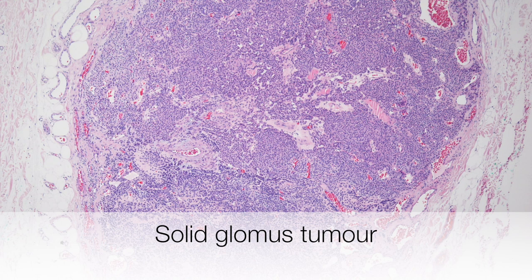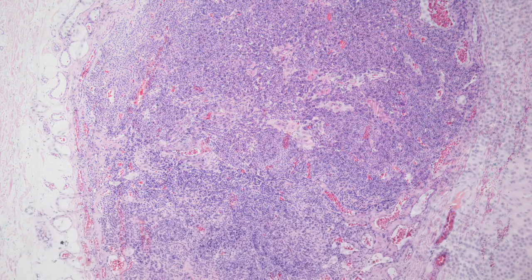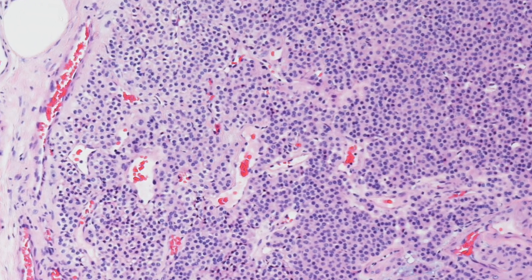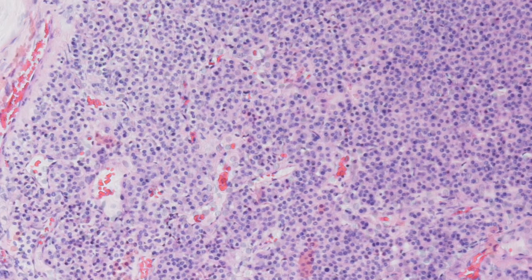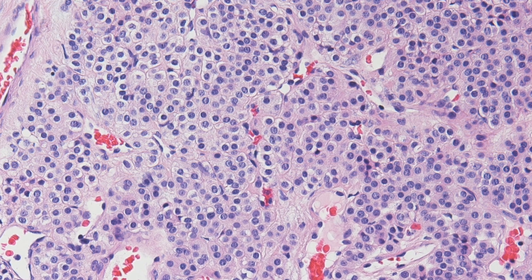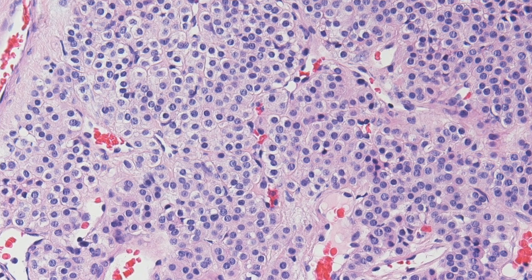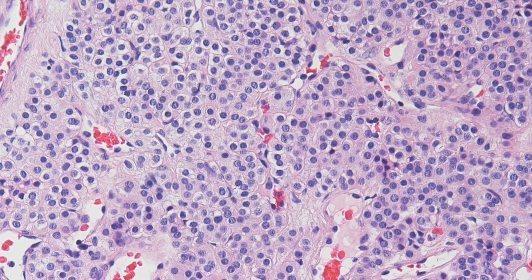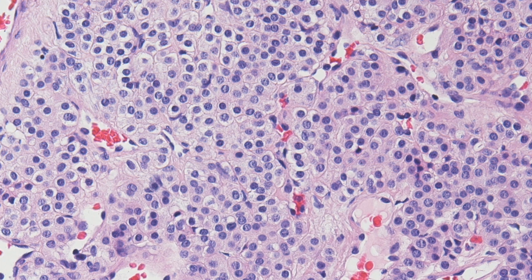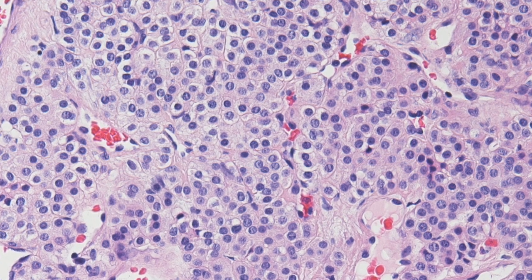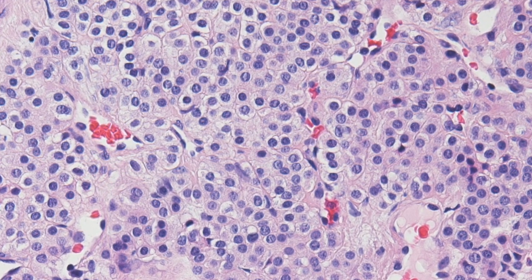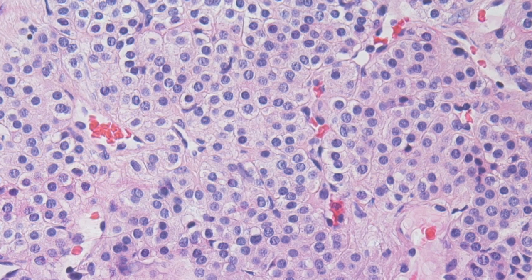This glomus tumour is composed of solid sheets of glomus cells, so this is a solid glomus tumour. At higher power, the pale pink staining cytoplasm can be appreciated and the nuclei are regular and round. The cell borders are also well defined.